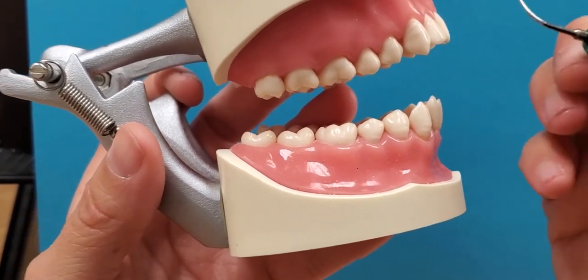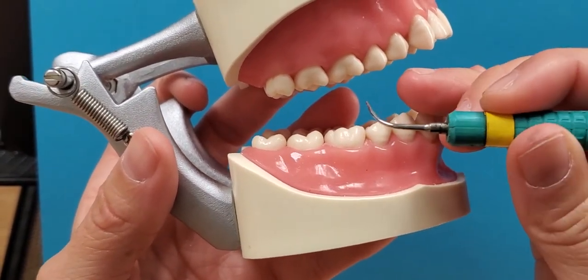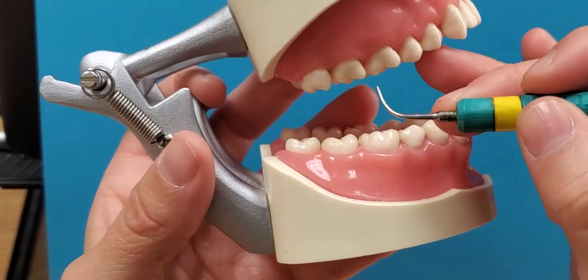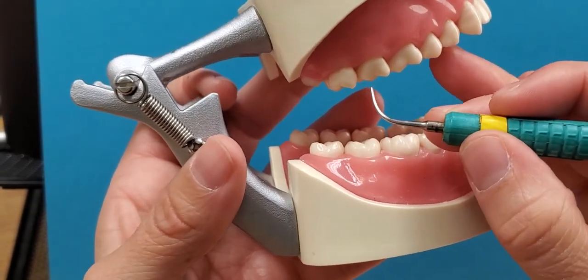We're looking at ultrasonic instrumentation. I want to show you the difference between two techniques. One is probe style ultrasonic technique.